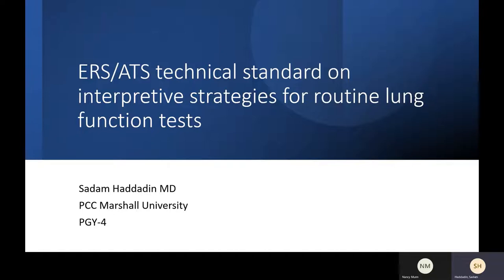If you have the one with the curve, this is a Z-score. Zero will be the median. Minus one or one is one standard deviation above or below. So that's 34 point something percent, I think. And then each one is another standard deviation. So they chose this line here at 1.6, which is kind of where 5% of the population below that would be, that they say abnormal. Though 5% may be normal, that is what they call abnormal. And then the same thing at the very top. So you will not lose patients or give false negatives or false positives. This patient lies in that small area, which is only 5% that could be normal.